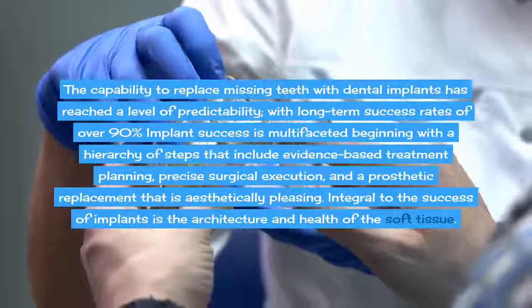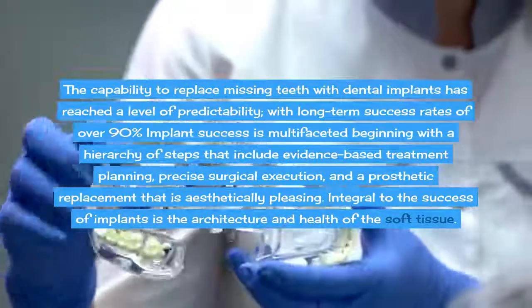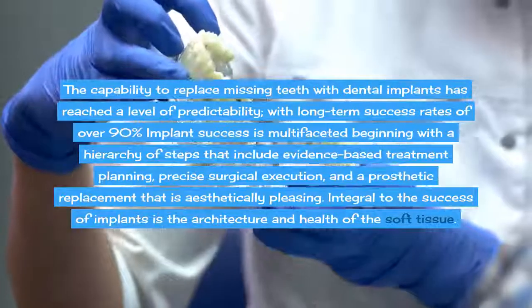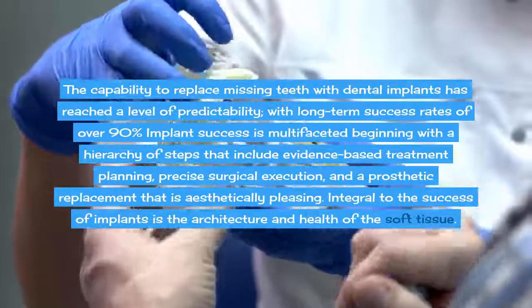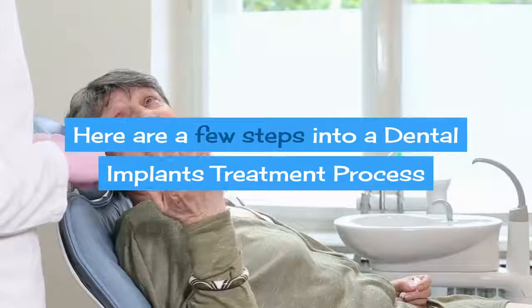Implant success is multifaceted, beginning with a hierarchy of steps that include evidence-based treatment planning, precise surgical execution, and a prosthetic replacement that is aesthetically pleasing. Integral to the success of implants is the architecture and health of the soft tissue. Here are a few steps into a dental implant's treatment process.